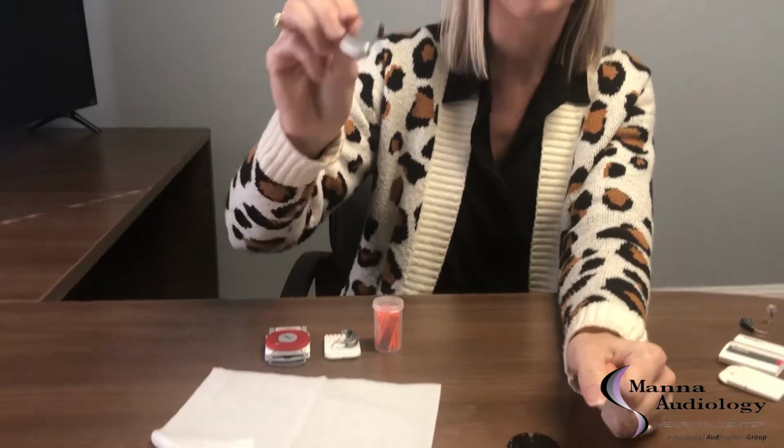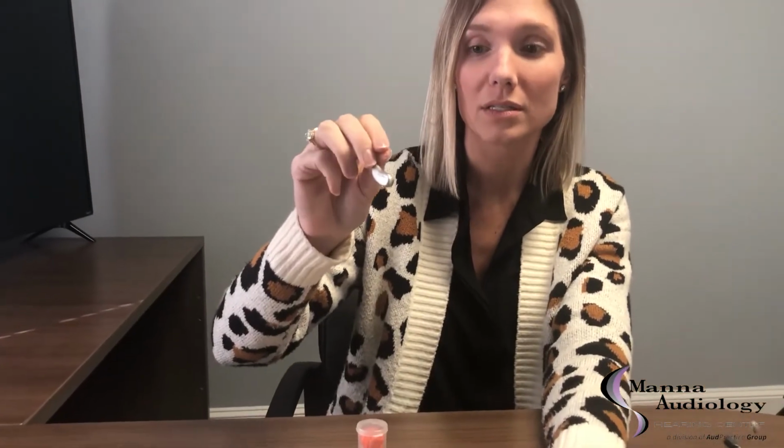So this is for the newer Phonak models. The older Phonak models look a little bit different, which I'll get into in just a moment. All right, the next one I wanted to show is going to be for Resound.